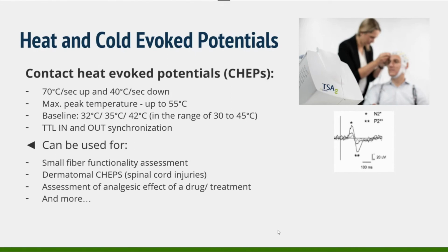Why is synchronization important? Because we measure in evoked potential two main parameters. You can look here at a picture of evoked potential. We measure the amplitude, N to P2, meaning how strong was the evoked potential, how intense, and we measure the latency. What is the latency? It is the time that passes from the moment the stimulation was given until the moment the evoked potential is visible in the EEG recording.